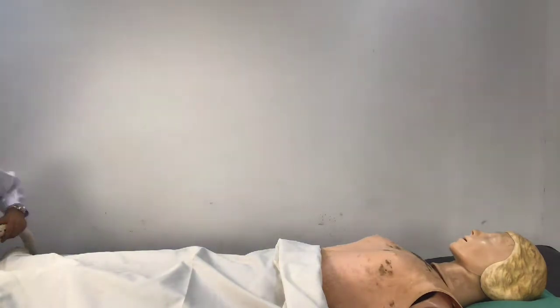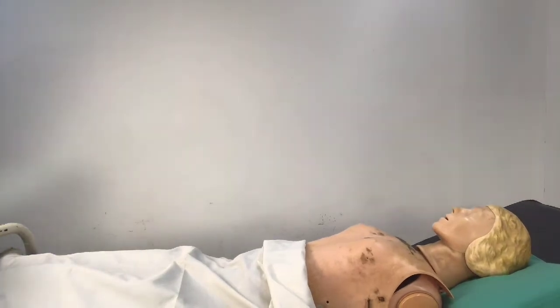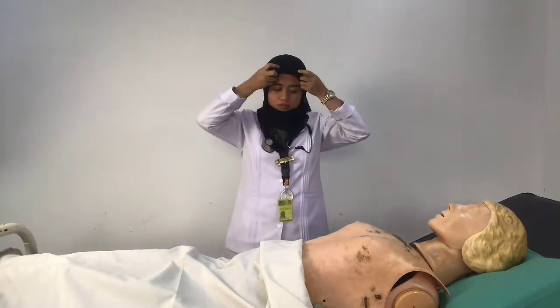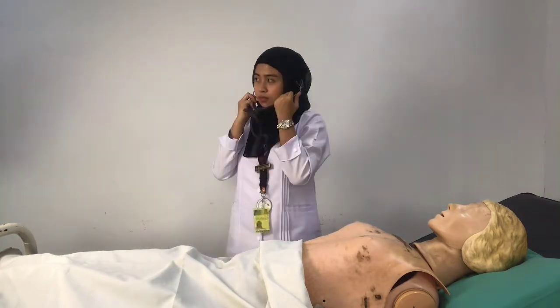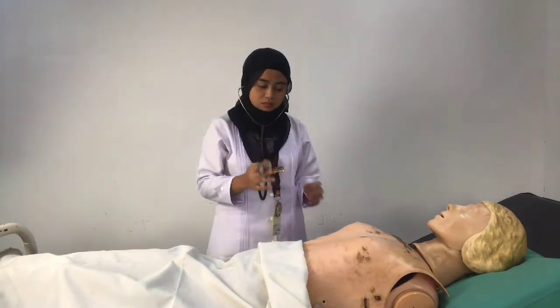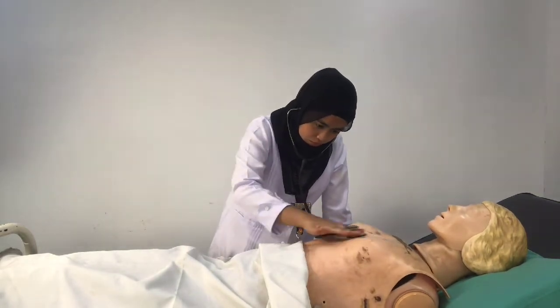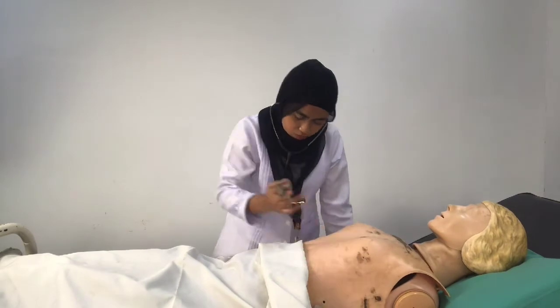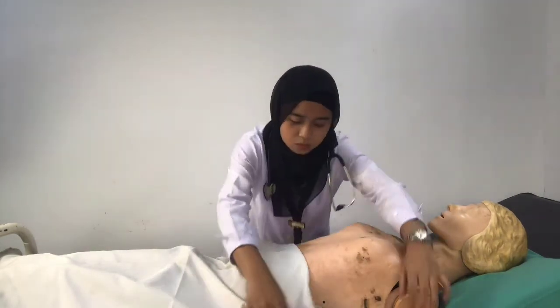Place the client in a semi-Fowler's position. Auscultate the aortic, pulmonic, tricuspid, and apical area. Use both the bell and diaphragm of the stethoscope. This is to identify S1, S2, or adventitious heart sounds. For peripheral system, inspect the peripheral veins in the arms and legs.